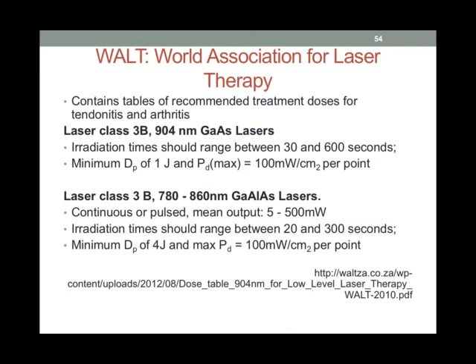Again, we are going to be using some of those references when we go over this in the lab. And what they've come out with is a couple of tables of recommended treatment doses for different diagnoses, in particular for different types of tendonitis and different types of arthritis.